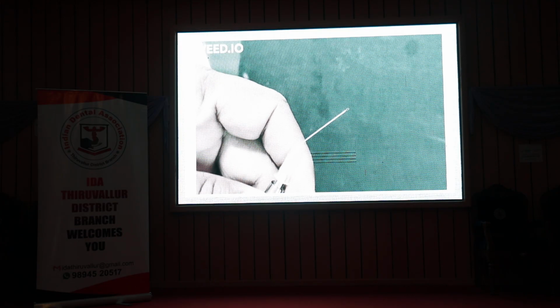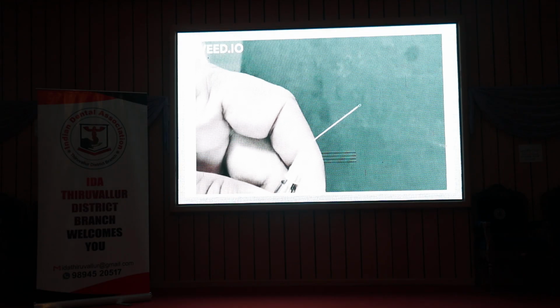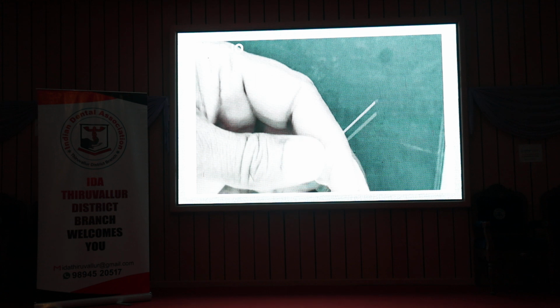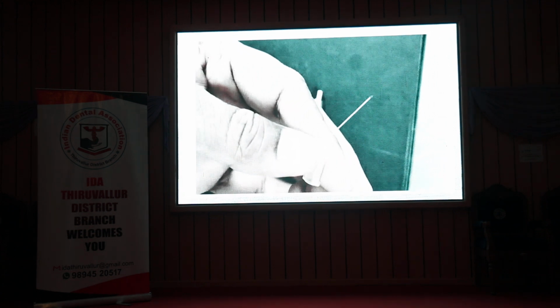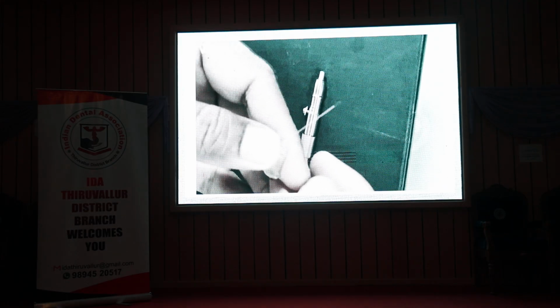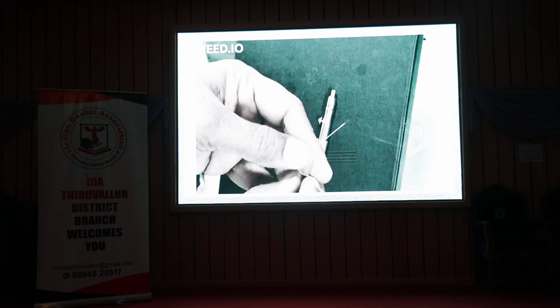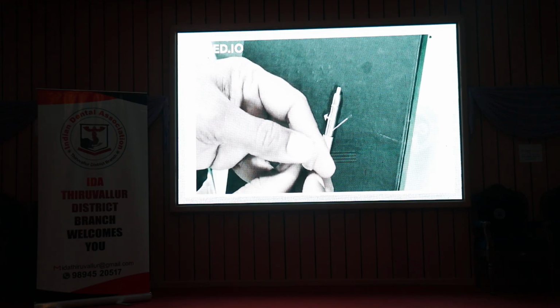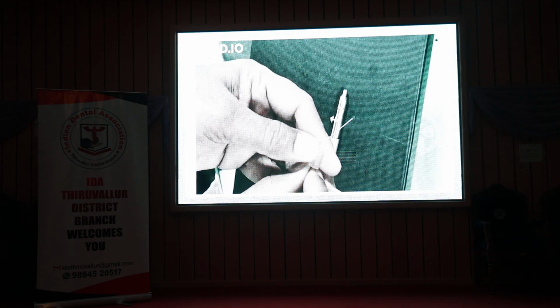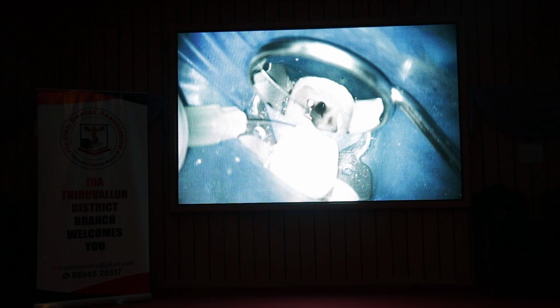That's so small. We'll just bend it at a 45-degree angle. And just try to, in the next case you can see the video. Okay, and then that loop can be adjusted. Here I am just pulling it out, but you can put it into that slider there and you can adjust it. Probably you will have the other half of the broken instrument, so we put this loop around that and then we try to identify it.